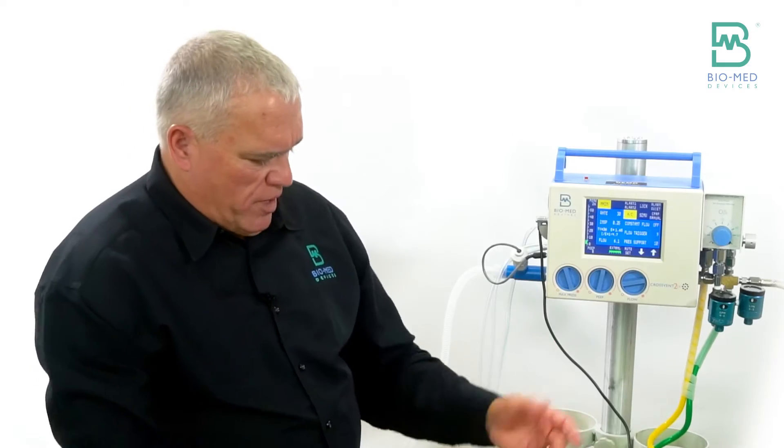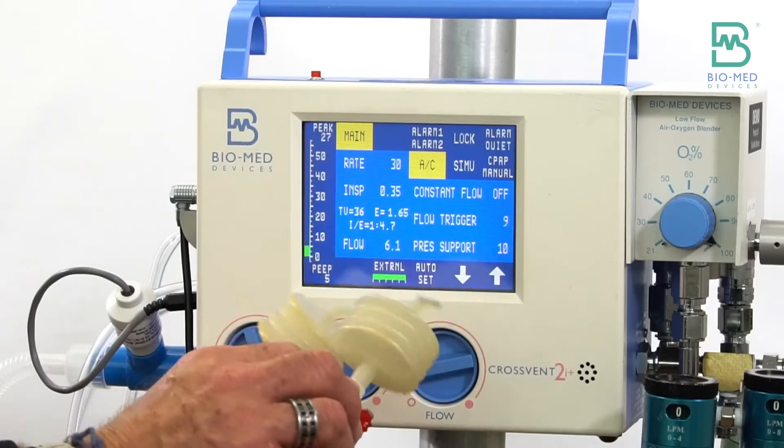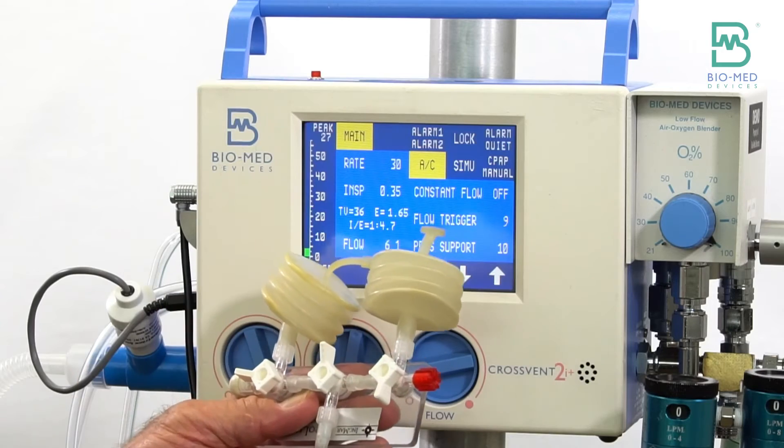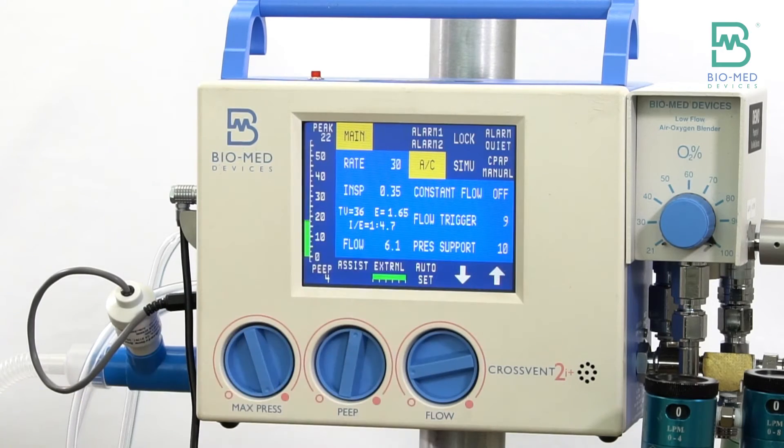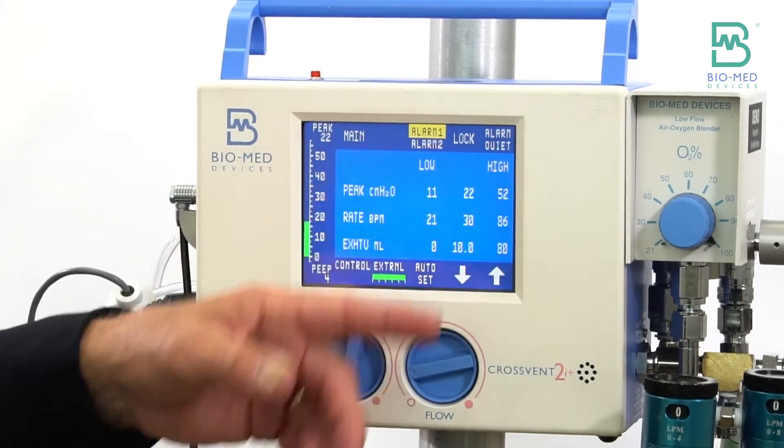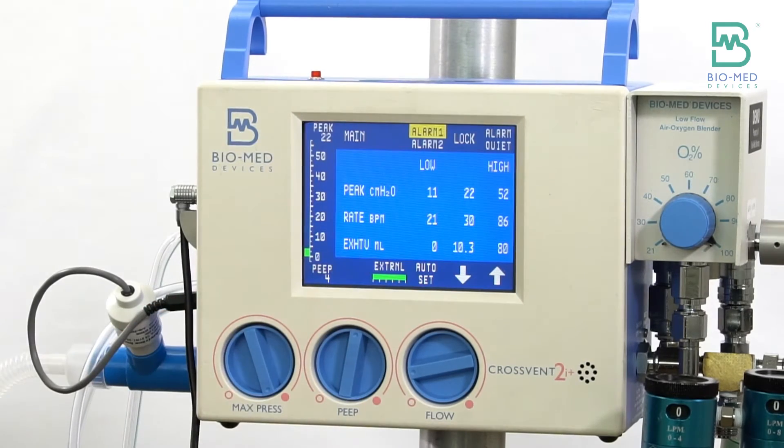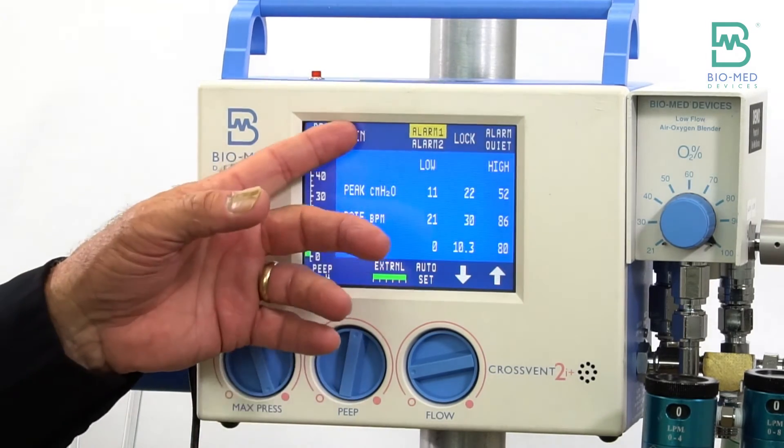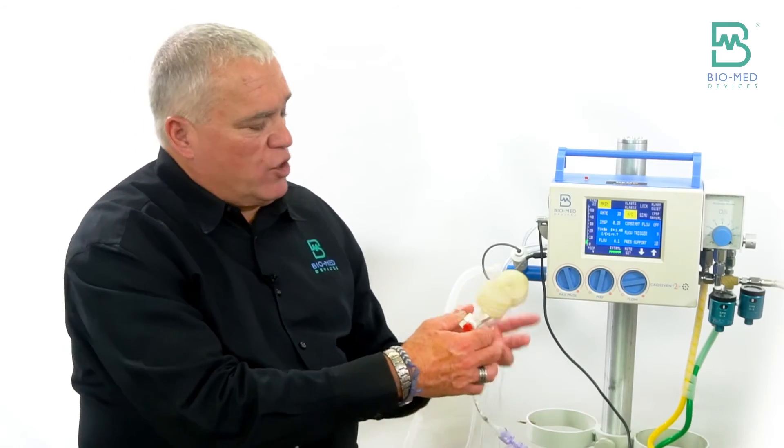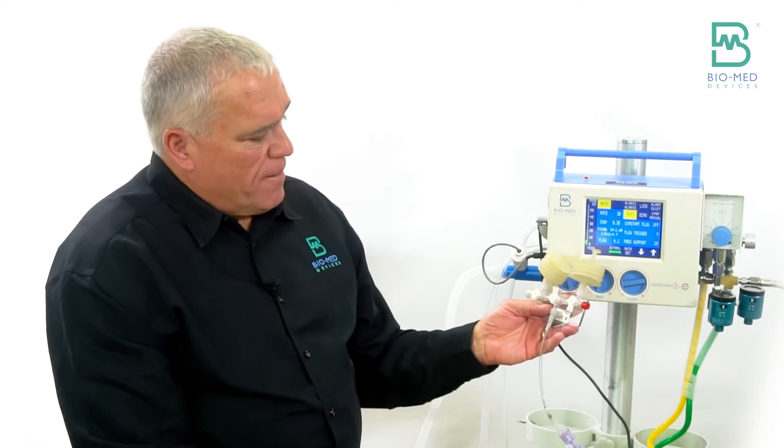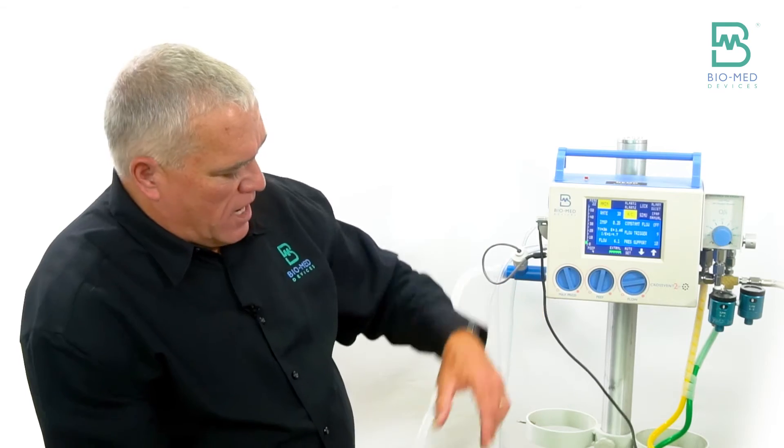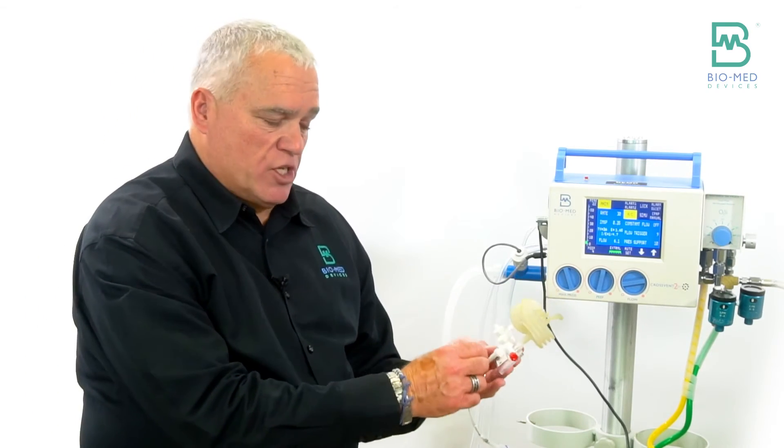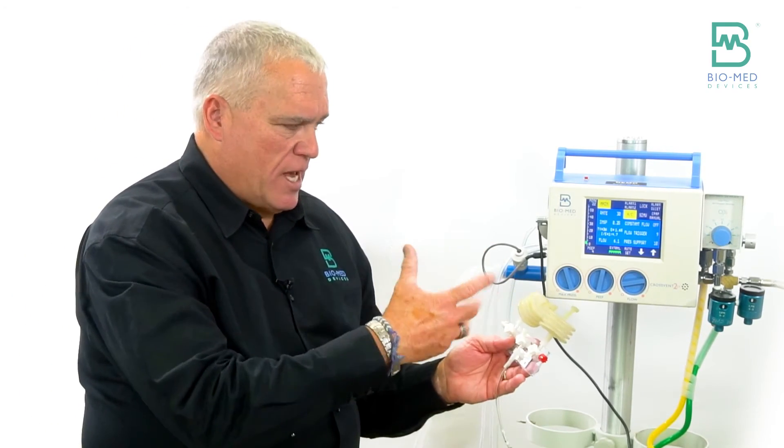Just be aware, because if I have a leak - so I turn on this leak - now all of a sudden instead of 20 I'm only getting 10. Well, you got to be careful because leaks can be positional in nature, so you turn the baby's head and you have a leak or you don't have a leak.